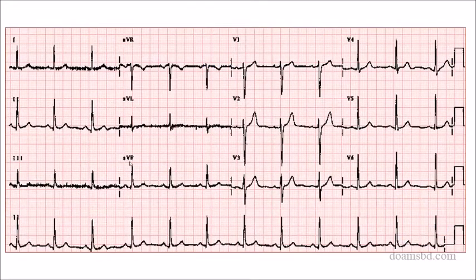Now come to that ECG. Can anyone identify any axis deviation here? Just think, doctor, for a second. You can unmute by yourself anytime, the restriction is not here right now. Just look at the ECG and try to identify: normal axis, left axis deviation, right axis deviation, or extreme right axis deviation. Just consider lead 1 and AVF, it is very simple, doctor.